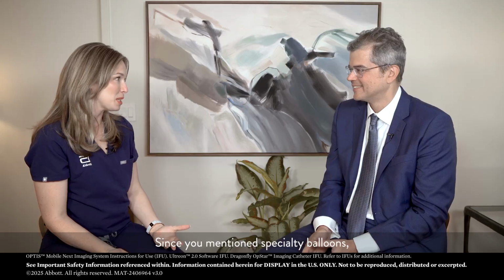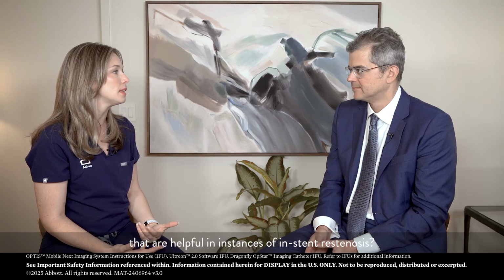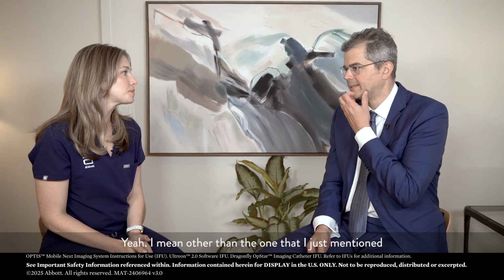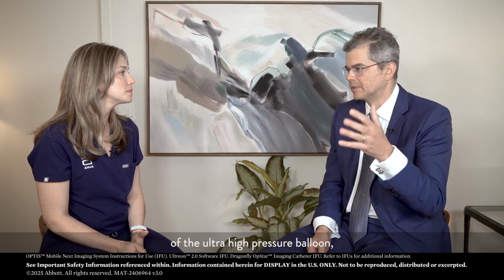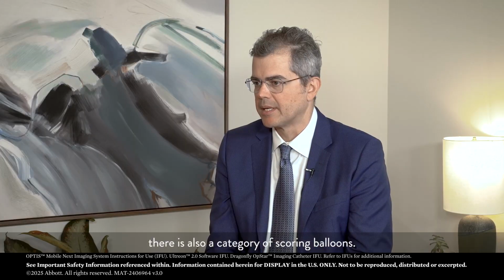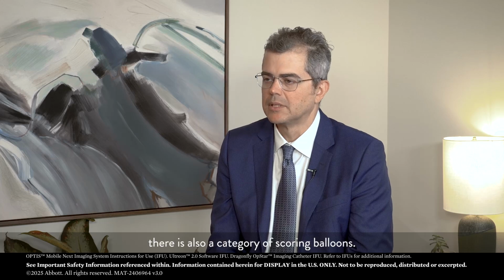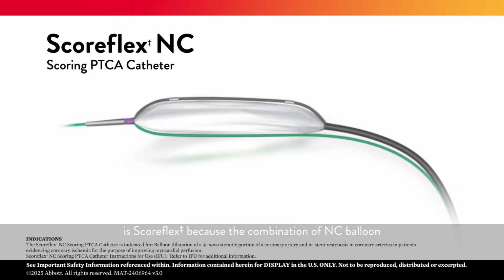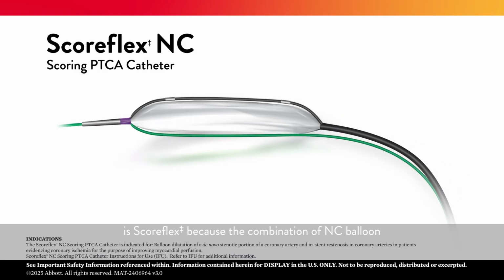Since you mentioned specialty balloons, what type of specialty balloons are available on the market that are helpful in instances of in-stent restenosis? Yeah, other than the ultra high pressure balloon that I just mentioned, there is also a category of scoring balloons. One in particular that is very interesting is ScoreFlex, because the combination of an NC balloon with a scoring balloon can be very effective.